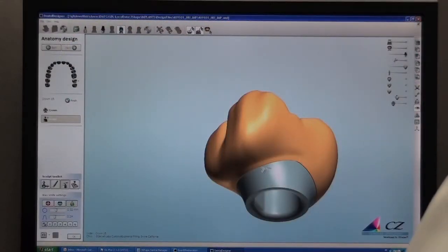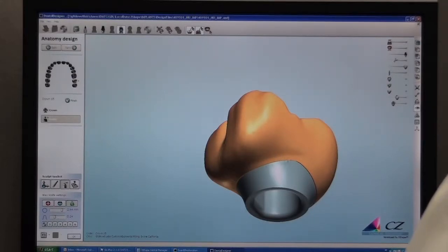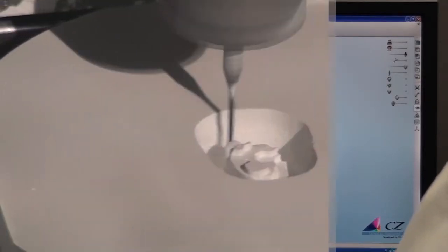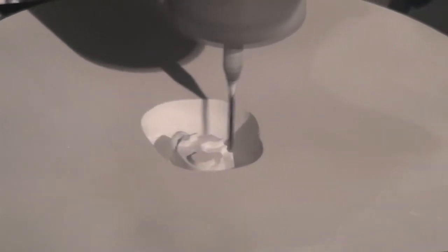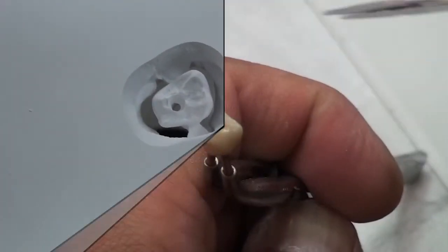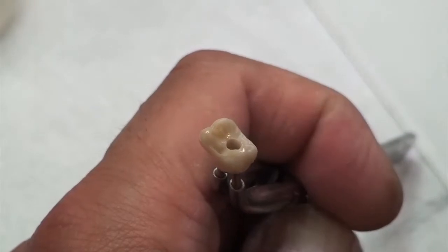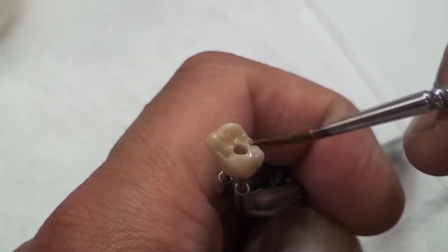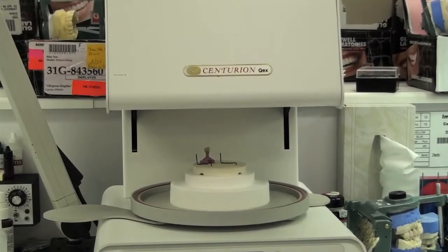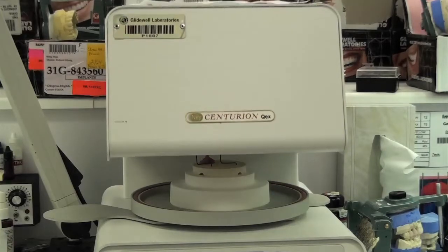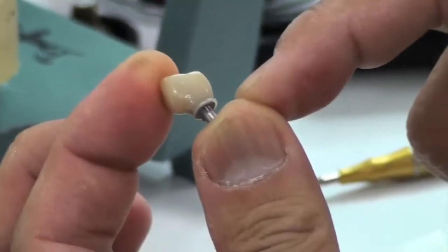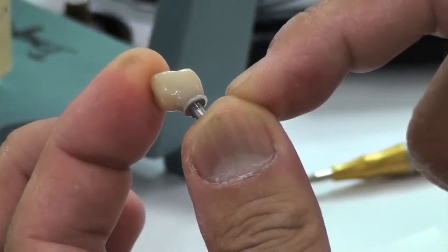In this case, we requested screw-retained Bruxer crowns. The crown and the abutment will be milled as one unit. Once the design is complete, it is sent over to a milling center. Here you see the restoration being milled from a solid block of zirconia. A base shade is added, and the prosthesis is sintered once milling is complete. Any final staining is then applied. The titanium base is luted into place, and the restoration is finished.